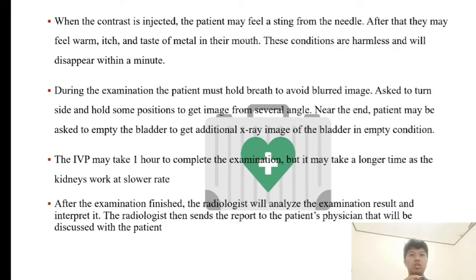When the contrast is injected, the patient may feel a sting from the needle, but it is harmless and will disappear within a minute. During the examination, the radiologist may ask the patient to hold their breath to avoid a blurred image, ask them to turn aside and hold some positions to get images from several angles, and near the end, the patient may be asked to empty the bladder to get an additional X-ray image of the bladder in the empty condition.